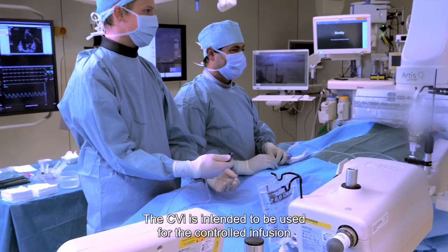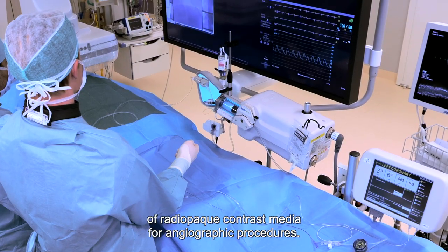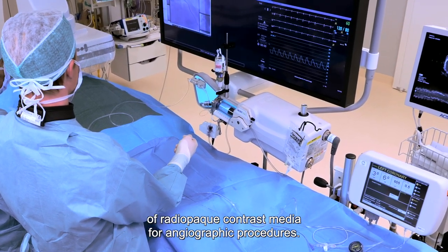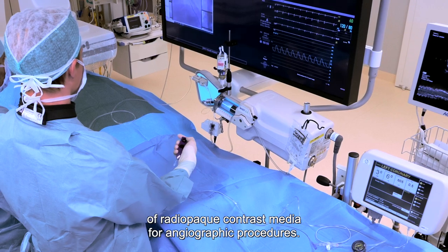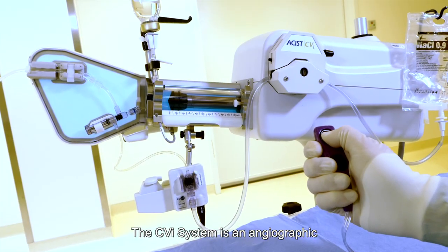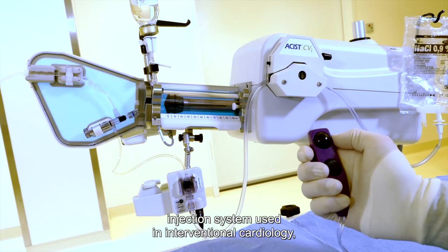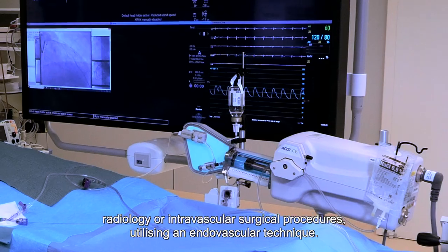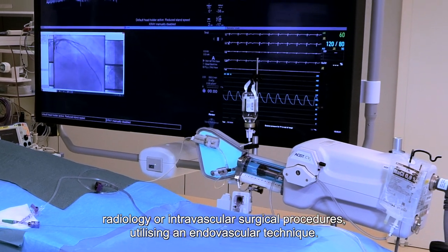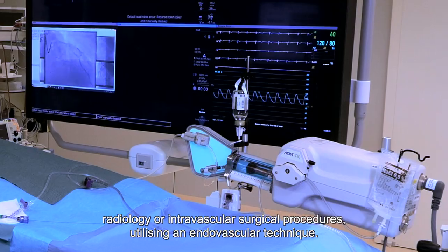The CVI is intended to be used for the controlled infusion of radiopaque contrast media for angiographic procedures. The CVI system is an angiographic injection system used in interventional cardiology, radiology, or intravascular surgical procedures utilizing an endovascular technique.